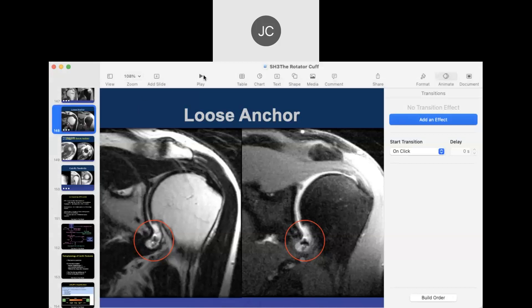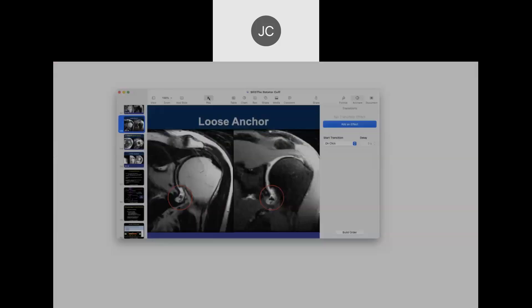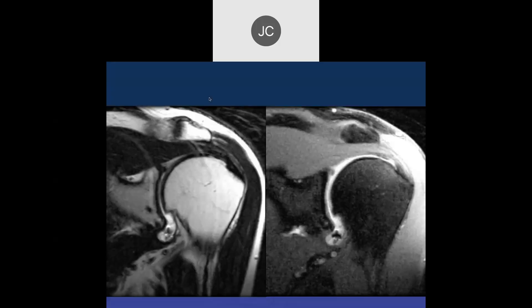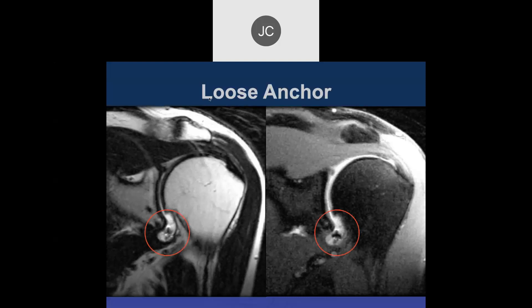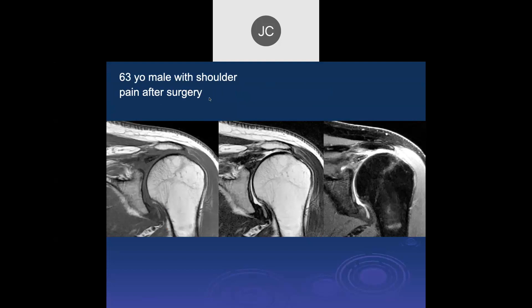We'll continue our march on the rotator cuff. We talked about this on a loose anchor. Jason, what do you think of this one? We've got a full thickness tear of the supraspinatus tendon, retracted almost to the glenoid ring.